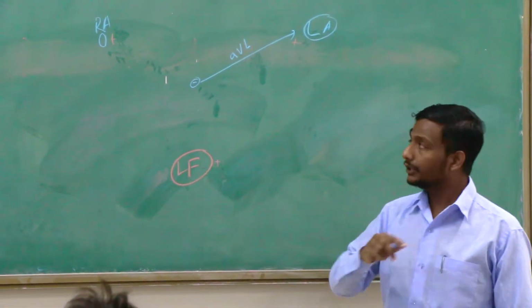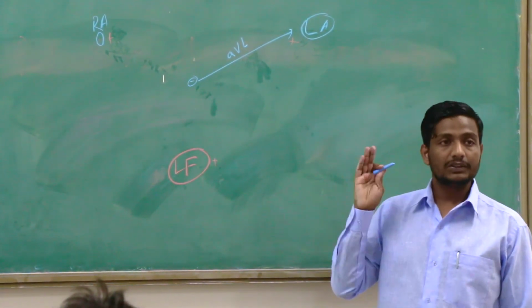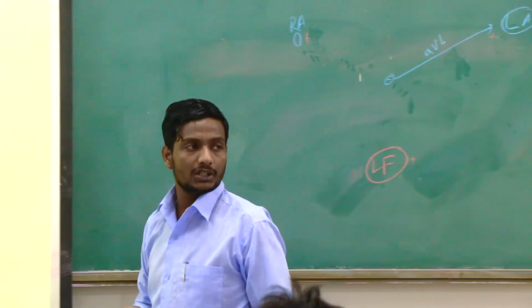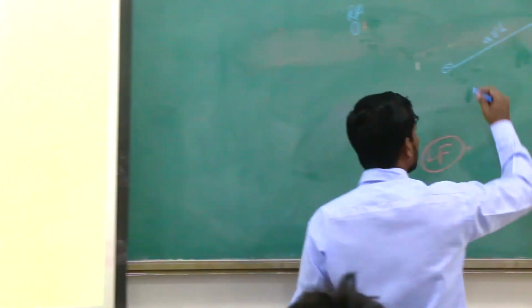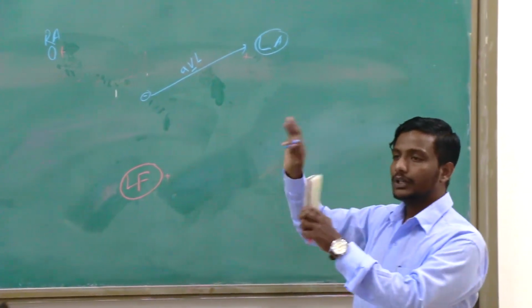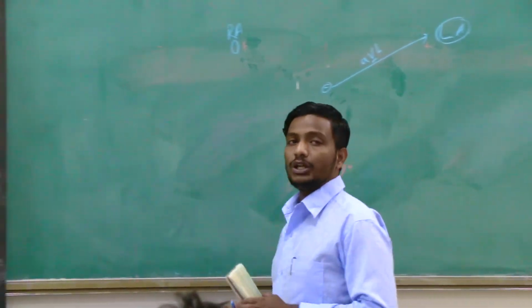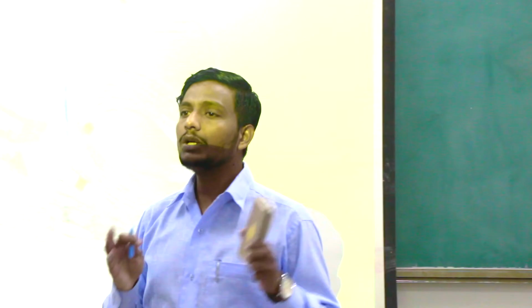By the way, let me tell you, whenever you see this letter A, it means this particular electrode has been augmented. Which electrode is the one to augment it? Right. The neutral electrode is the one to augment it. So A. And I am giving you one hint here. Whenever you see this letter V, you convert the V into U, and remember, U as unipolar. You are going to remember them as what? Unipolar. Just an easy way for you to remember this.